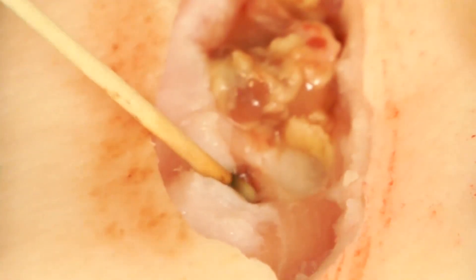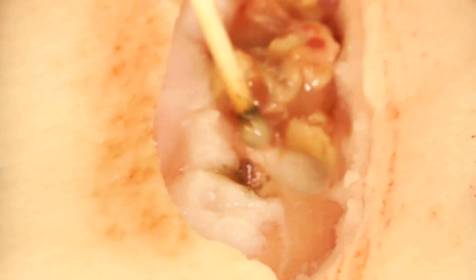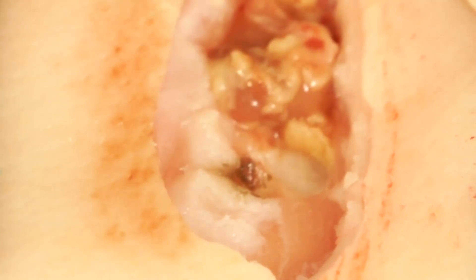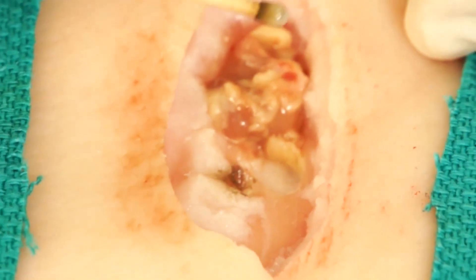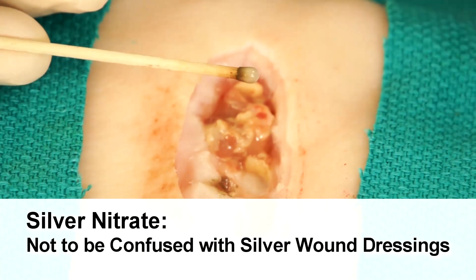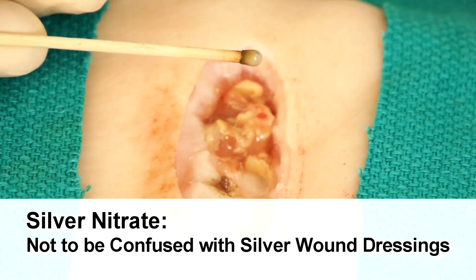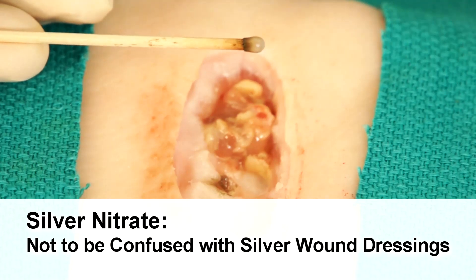You will see now that the wound bed has a small gray to black discoloration. This is the silver nitrate that has been left behind, and you can also see that hemostasis has been achieved and there is no ongoing hemorrhage. Silver nitrate is distinctly separate from other wound products that contain silver. It is not a product used for achieving bactericidal or bacteriostatic wound healing — it is only a medication used topically for the treatment of bleeding or hypergranulation.